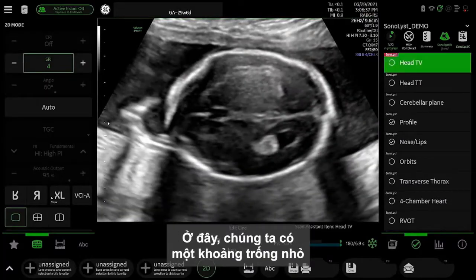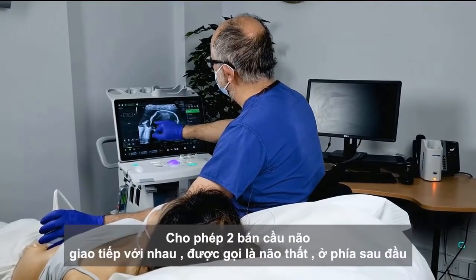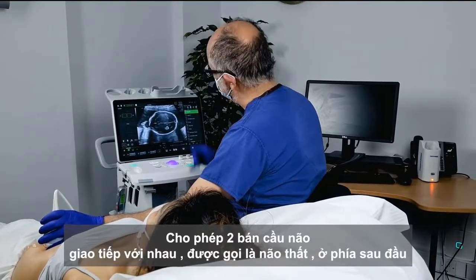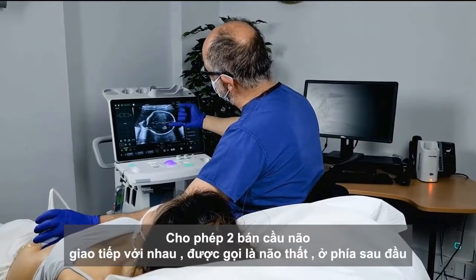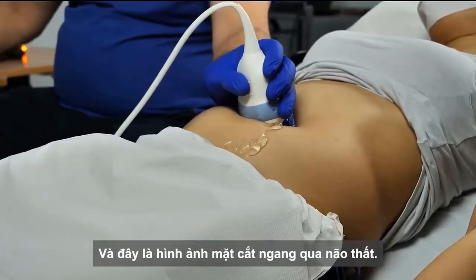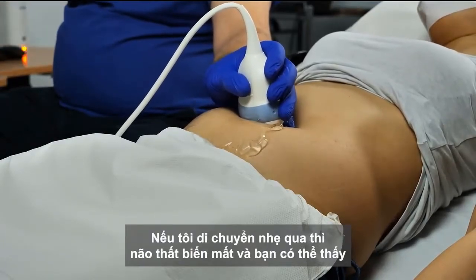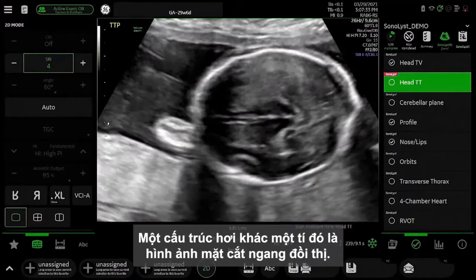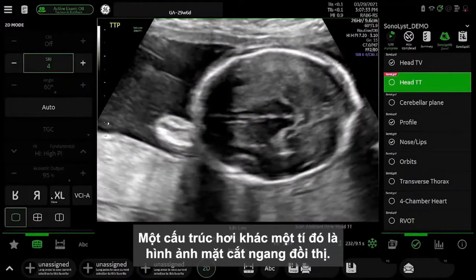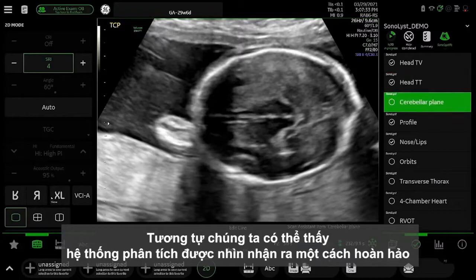So here we have a little space which allows the two halves of the brain to talk to each other. This is called the ventricle here at the back of the head. So that was the transventricular view of the head. If I move just slightly, then the ventricles disappear and you see a slightly different structure, which is the transthalamic view of the head. And again, here you can see that's being recognized.